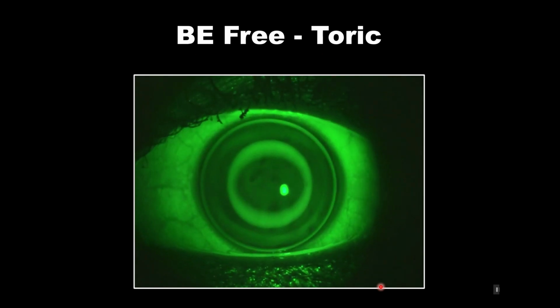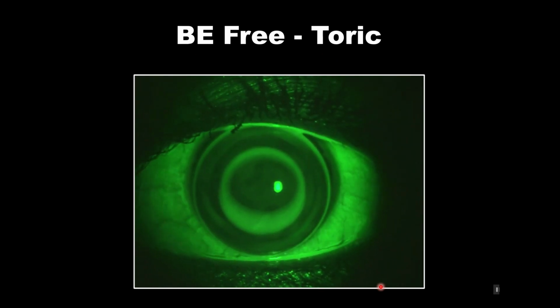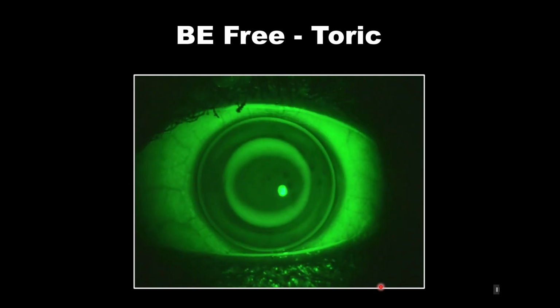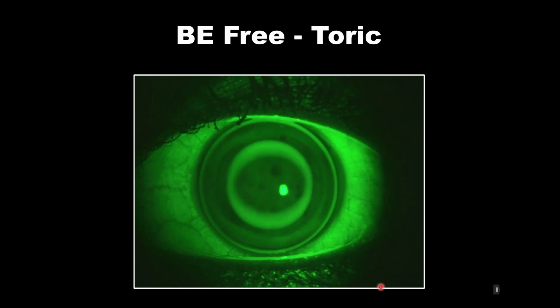And then when we place that lens on eye, you notice having the appropriate depth on the flat meridian as well as the steep meridian, and we get a much better lens to cornea relationship, better centration.